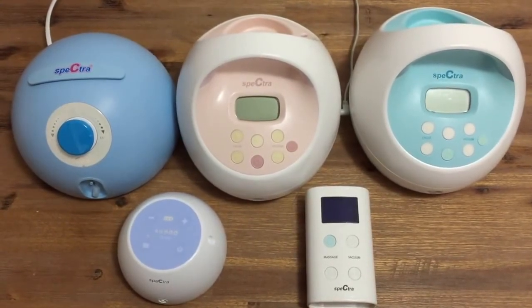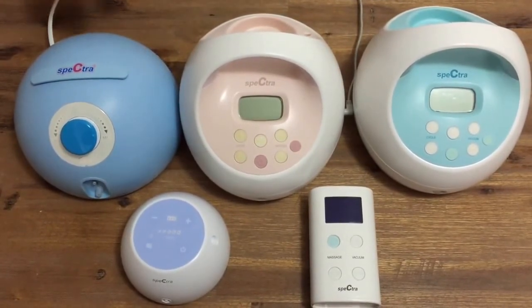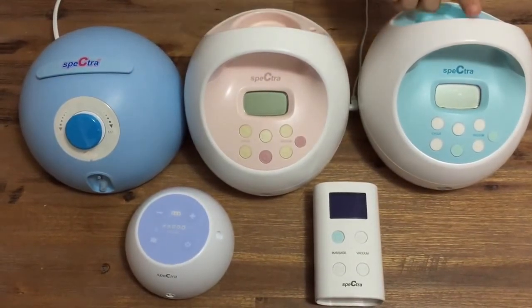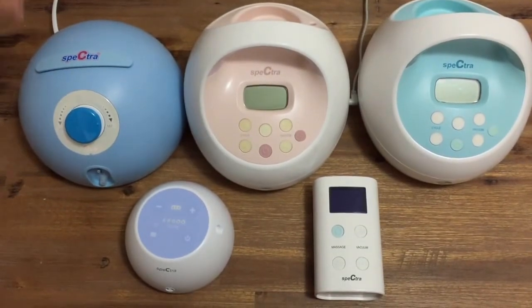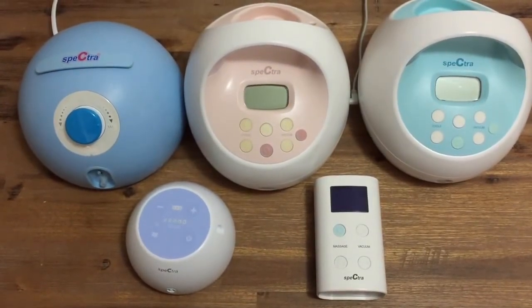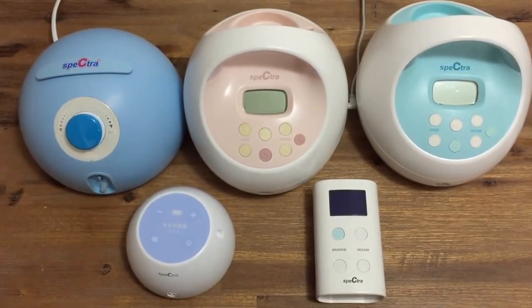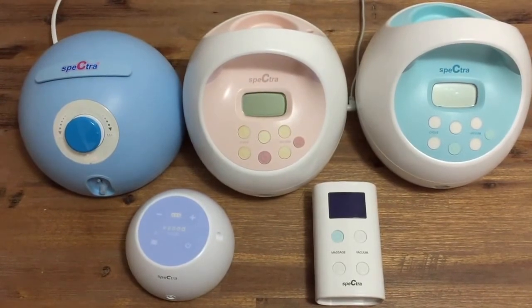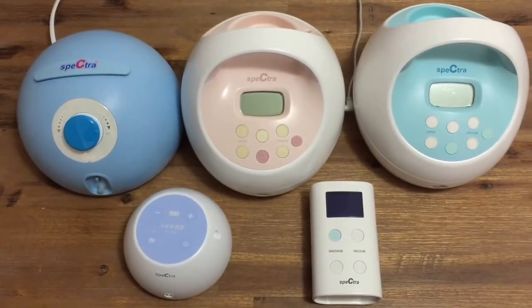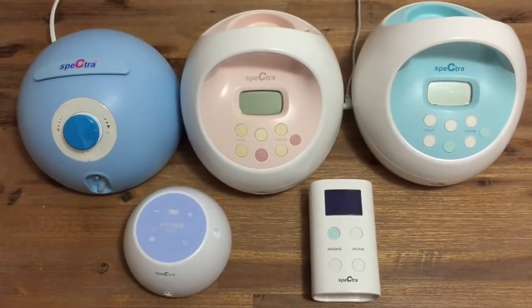Spectra Baby Australia offers two types of breast pumps: hospital grade and personal use pumps. The hospital grade pumps are the G350, which comes in pink and in blue, the Spectra S2, and the Spectra S1. Our personal use pumps are the Spectra M1 and the Spectra 9+. Hospital grade breast pumps are designed for heavy use, have a powerful motor and very strong suction, and are capable of initiating and supporting your milk supply. Personal use pumps are much smaller and lighter in weight, and are best used by mothers who are not needing to rely on the pump to replace breastfeeding or to maintain their milk supply.